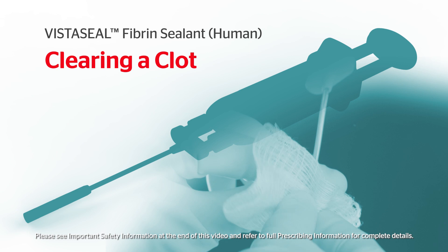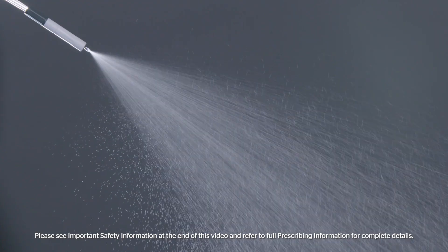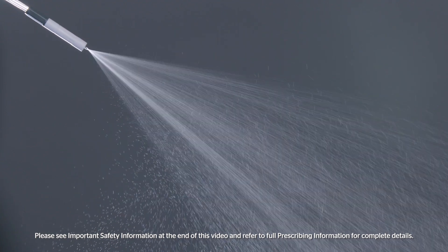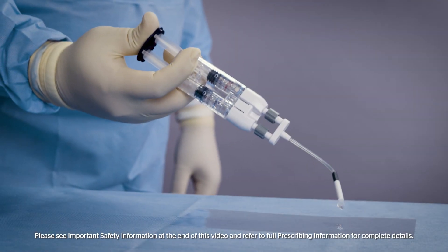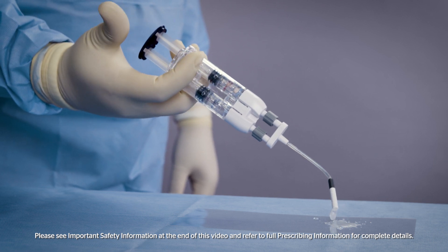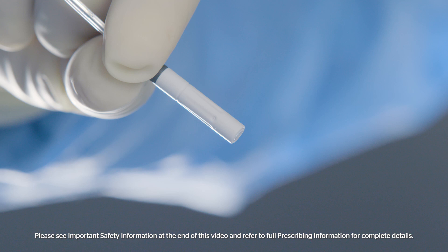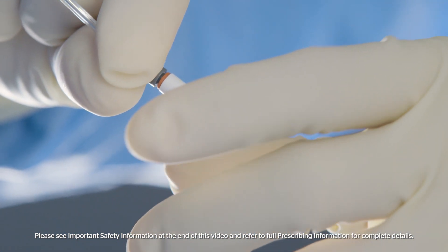VistaSeal is designed to deliver a rapid, adherent and durable clot. Once spraying has stopped, a clot will form in the airless spray tip. Do not try to push hard to clear the clot. If expression is stopped for any reason, remove the airless spray tip by twisting counterclockwise.